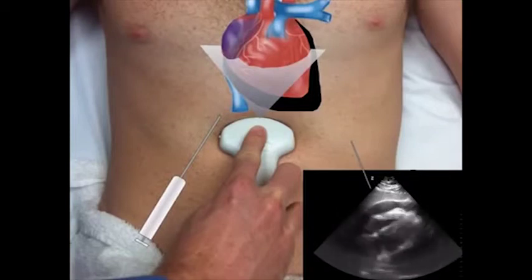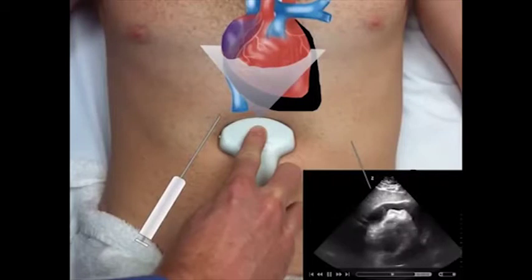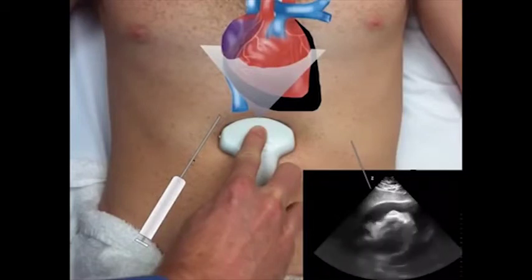This is an example of performing an ultrasound-guided pericardiocentesis from the subcostal window. The steps that we mention here are pretty much the same steps that you would use for the apical window, the only difference being the orientation of the ultrasound probe. For this particular example, we're using a curvilinear abdominal probe. However, you could also use the thoracic or phased array probe for this particular image. Here we're looking at a heart with a fairly significant diastolic collapse of the right ventricle and a fairly large effusion. We're going to be coming through the liver here, and we're actually visualizing the pericardium through the liver. I'm going to insert the needle just lateral to the probe to the patient's right side. That way I'll be going through the liver and towards the patient's pericardial sac.